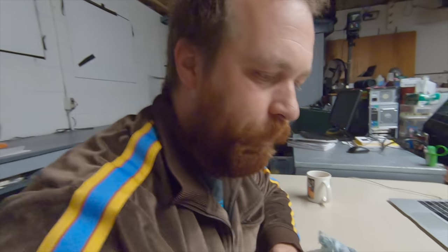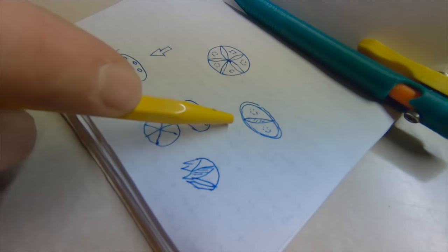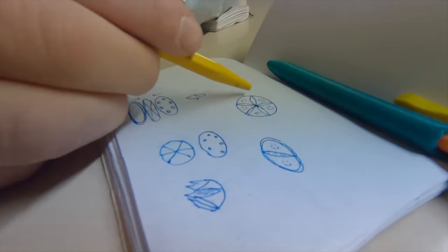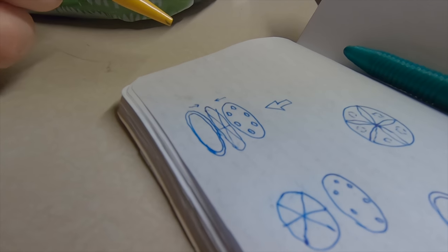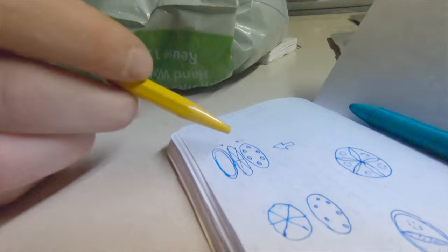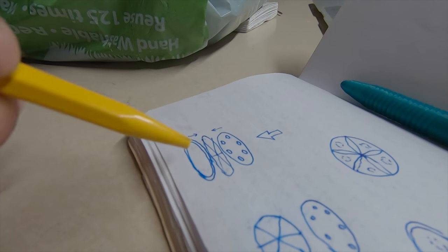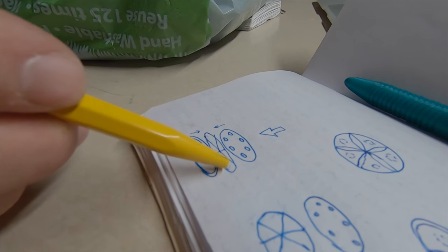So I guess the heart valve was like this thing with two holes here and a slit where they could be blown open. These holes can't be really big because a flexible membrane like that will get sucked through the holes. So you came up with this sort of sand dollar, multiple slit, multiple hole type of thing. And so I think this could be produced really, really quickly and efficiently. So what I'm going to do is make, again, two hose fittings, but one side hose fitting is going to have this plate on it. And then the other side is going to just screw and hold this membrane that we should be able to cut with just a mat knife or a scissors.